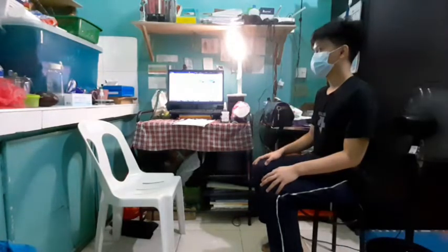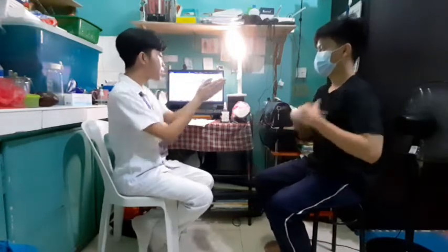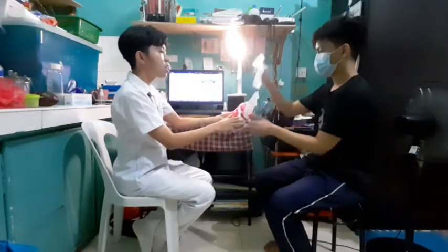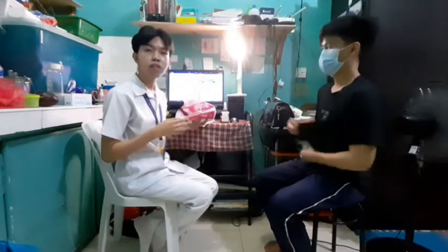I will ensure the client's privacy by closing the door — or sliding the curtains if the patient is in a ward. I'll ask you to pat your axillary area or underarms dry with toilet paper. The purpose is to remove any moisture from the client's underarms, because moisture can contribute to false or inaccurate readings in temperature taking — moisture can lower the temperature reading. Can you please discard that? Thank you.